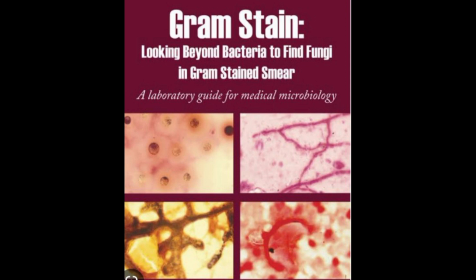Instruct to collect a high vaginal or cervical swab, avoiding contamination, with a sterile cotton swab, and transport the specimen to the laboratory within 1 hour of collection. Do not accept dry swab specimens from other labs or hospitals. Pus: instruct to collect the specimen in a sterile screw cap test tube or to send in an aspirated syringe. CSF and other body fluids: instruct to collect the specimen in a sterile screw capped test tube.